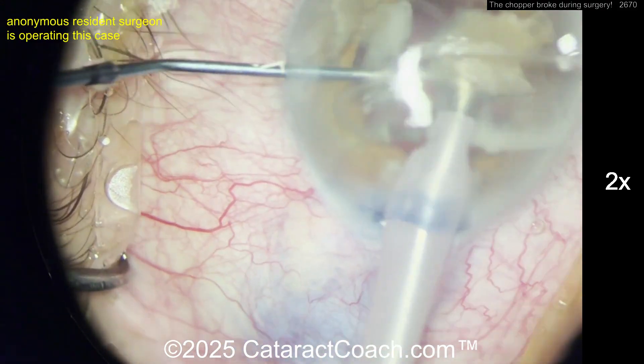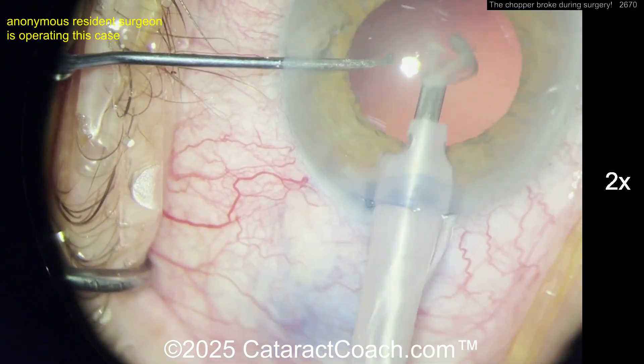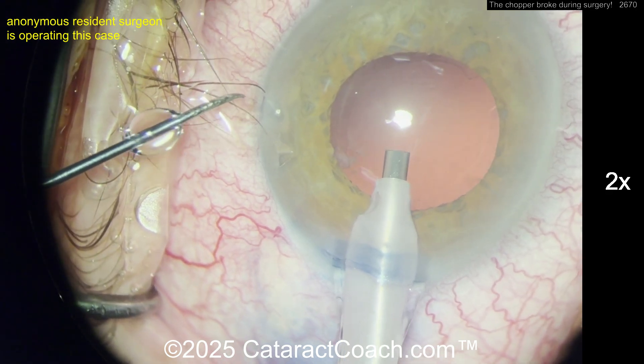Removing the nucleus — that comes pretty nicely and smoothly. The video is sped up here because I want to show you the good part, which is coming up right about here. Look at the chopper as the surgeon is operating, and pulling out of the eye — pow — the chopper tip breaks off in the paracentesis.